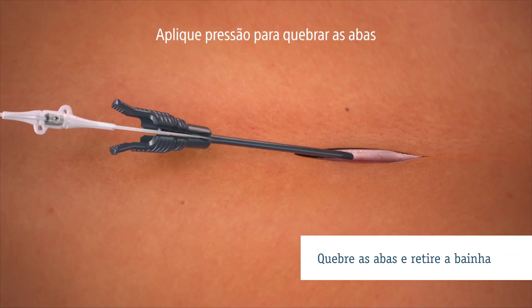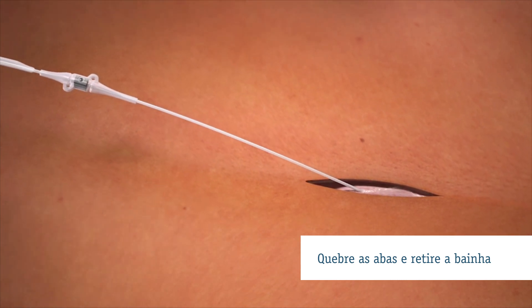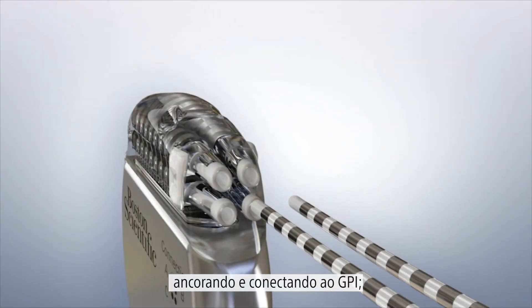Apply pressure to break the tabs and peel apart the sheet. Finalize your procedure by anchoring and connecting to the IPG.